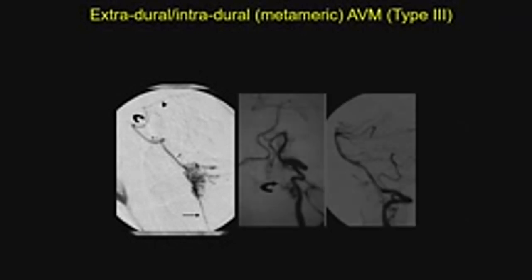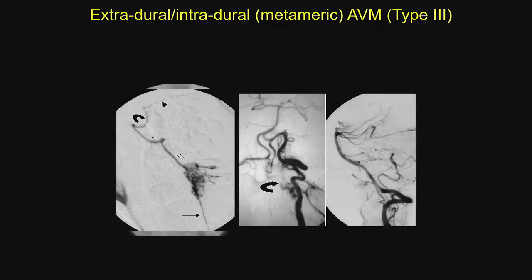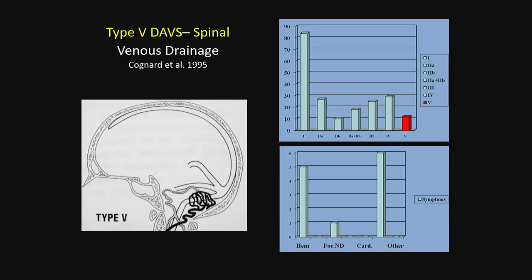So the next picture shows you after several sessions, obliteration with preservation of the anterior spinal artery. There is some piece here in the soft tissue left, which is not important for the cure of this disease itself. But the goal was, again, the spinal cord component. This is how it looks on CT scans close to the dens itself.